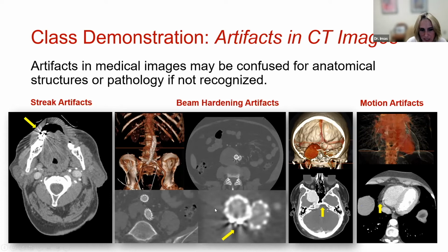In this case, you have an abdominal aortic stent, or graft, and you can actually take a look here. You can clearly identify it in the image, and the streaks that you see, and I have an arrow pointing to that, are the very common beam hardening artifacts. That's really from the graft itself. Again, this is fairly straightforward, fairly easily recognizable.